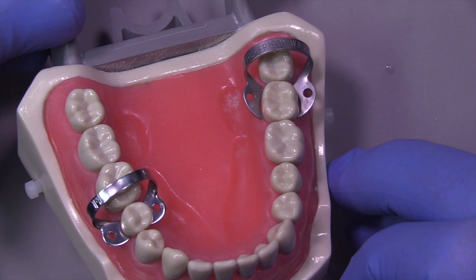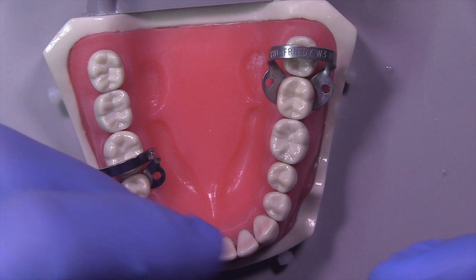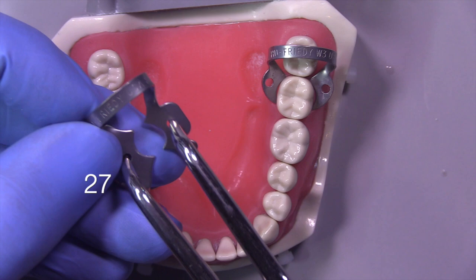If you're taking a board exam and your rubber dam clamp damages the tissue, that could be a deduction in points, so you want to be very careful about that.